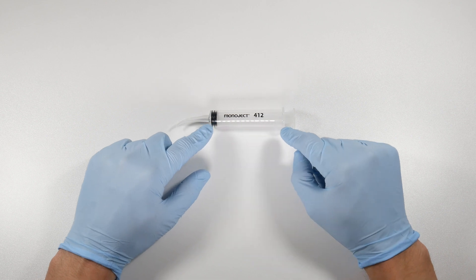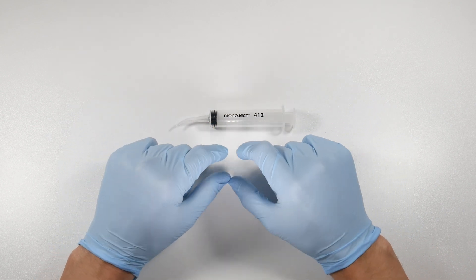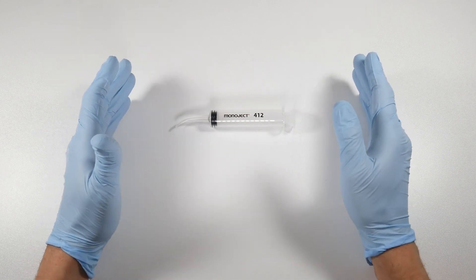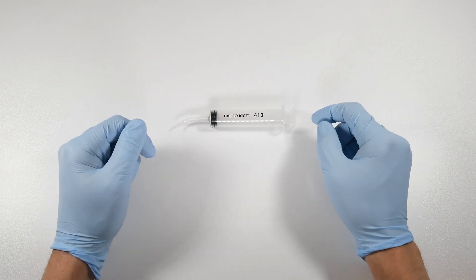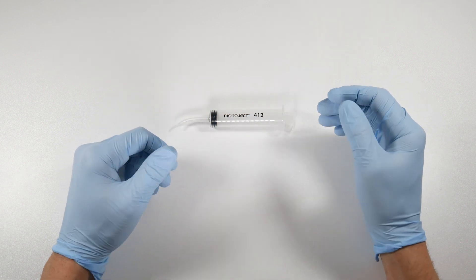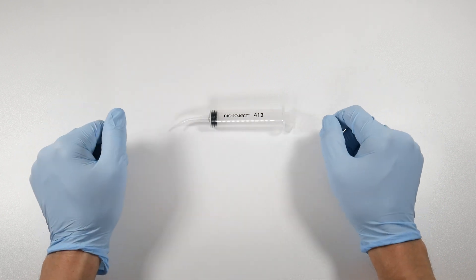It might be better to invest in some larger syringes that have that capacity, like a 50 mil syringe or 80 mil syringe, whatever you can find that will allow you to then irrigate the site fully without reloading syringes or having multiples prepared ahead of time.